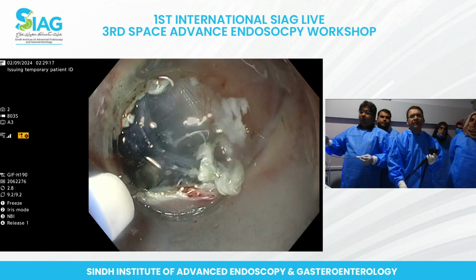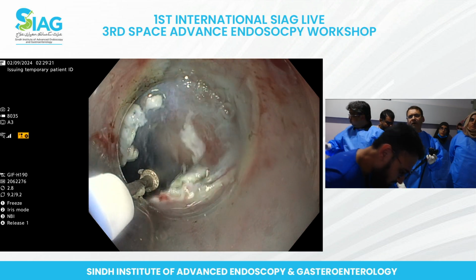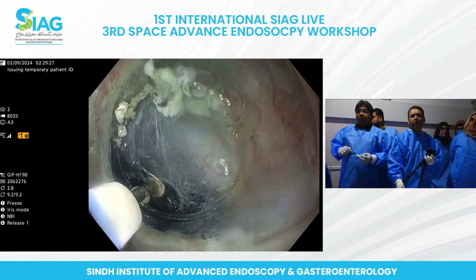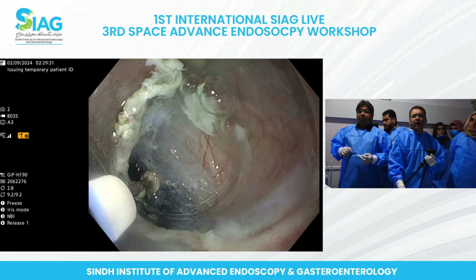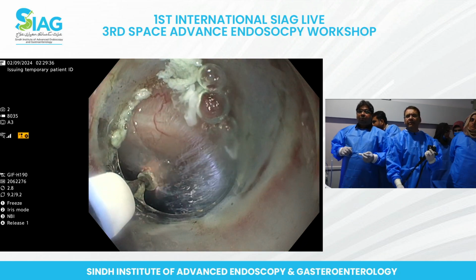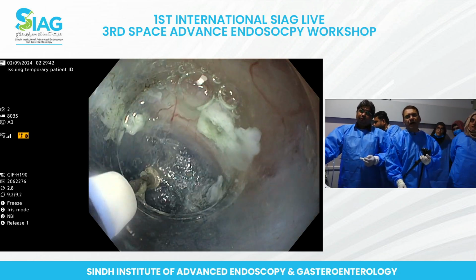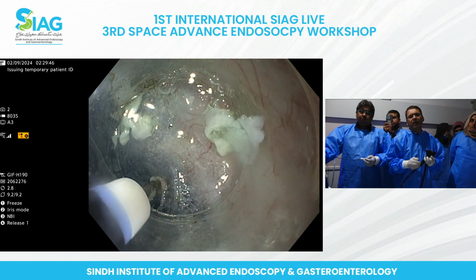So the main thing is, now go back to myotomy. Here you have to make sure that you keep pressing the button and go using the right settings of the cautery. And if you look here, I'm just pressing a little bit on that paddle and just creating a space for me. So now I'm into the tunnel. You see the muscle on the front side. I will push this out a little bit more.